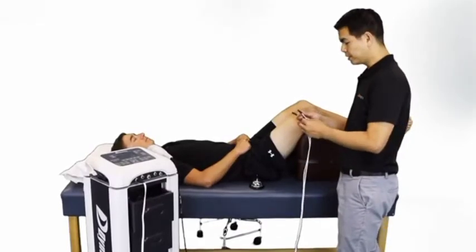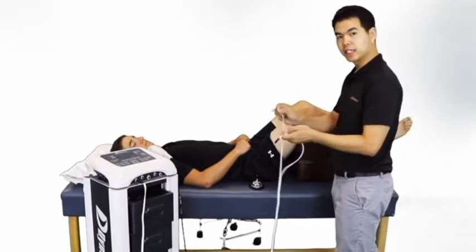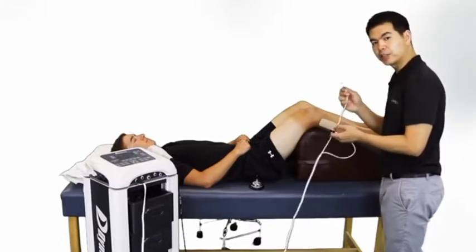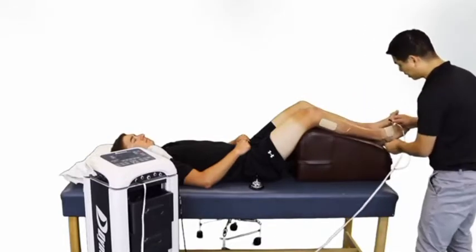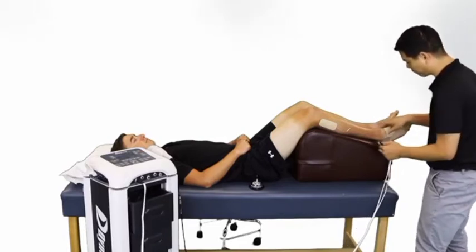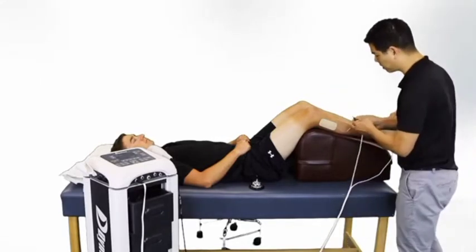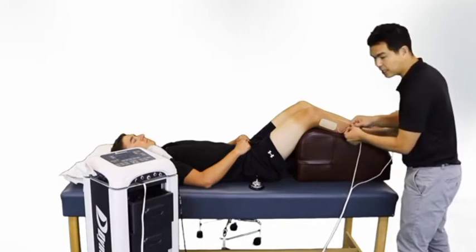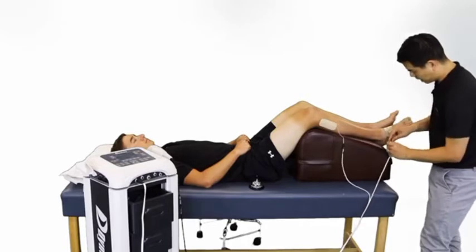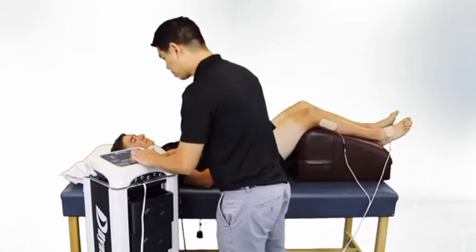As we attach the leads, notice that one of the leads is marked active, one of the leads is marked dispersive. So the active lead is the lead that I'll use and change the polarity to negative. The swelling typically is charged with a negative polarity, and so we'll use a negative polarity from the electrode here to push the swelling out of the ankle towards the positive polarity at the dispersive electrode. Dispersive, active, and we're going to set the polarity here to negative.